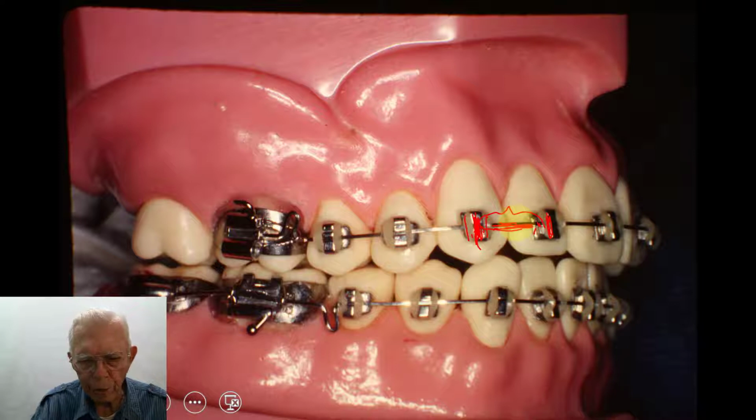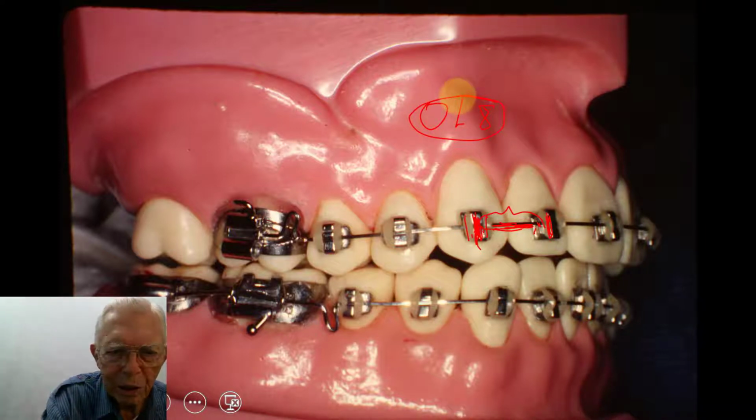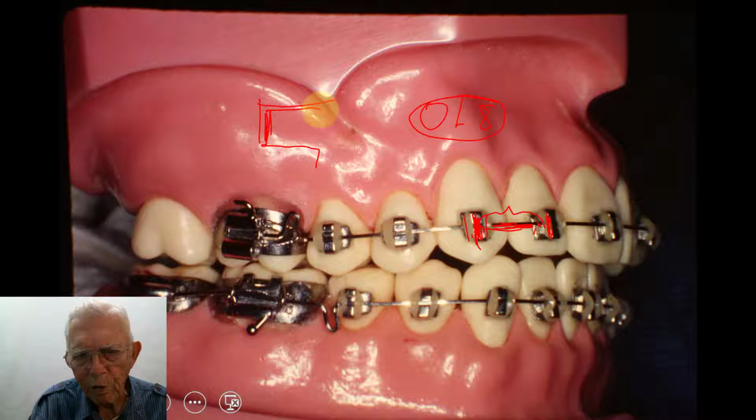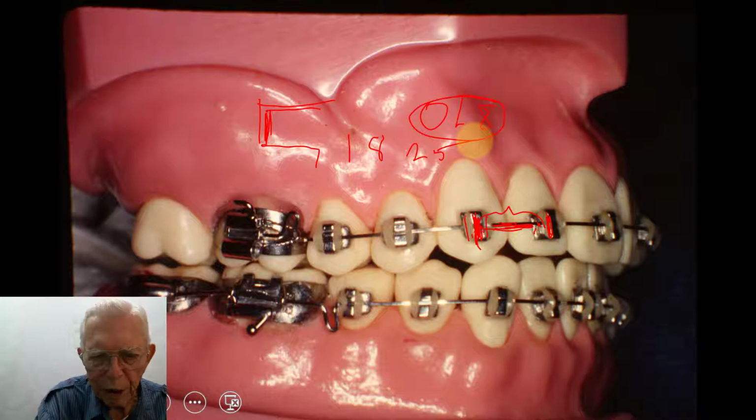And if you're using a real big wire, I use an 018 bracket, what I call a 018. It's an 18 thousandths bracket. The bracket would be something like this. This is 18 thousandths here, and this is 25 thousandths. So it's an 1825 slot in the bracket.